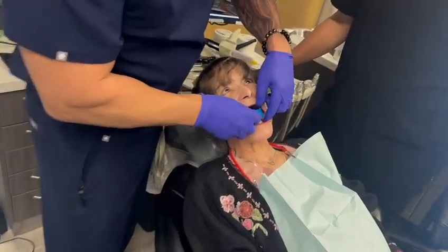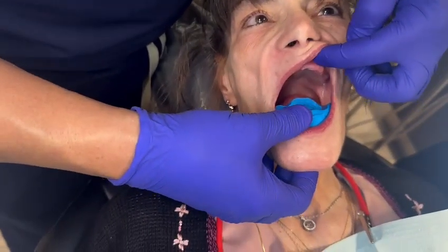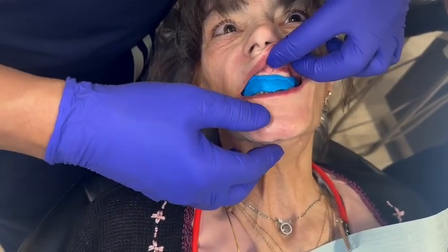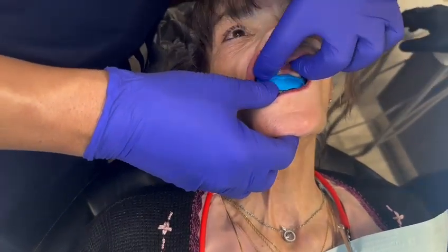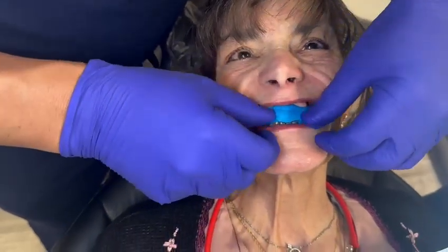We've got to put this in. Look right at the teeth here. Let me have you pull your tongue back. Bite down a few times. The first one, we really watched our condylar centric, and then we added putty to it twice to increase vertical.